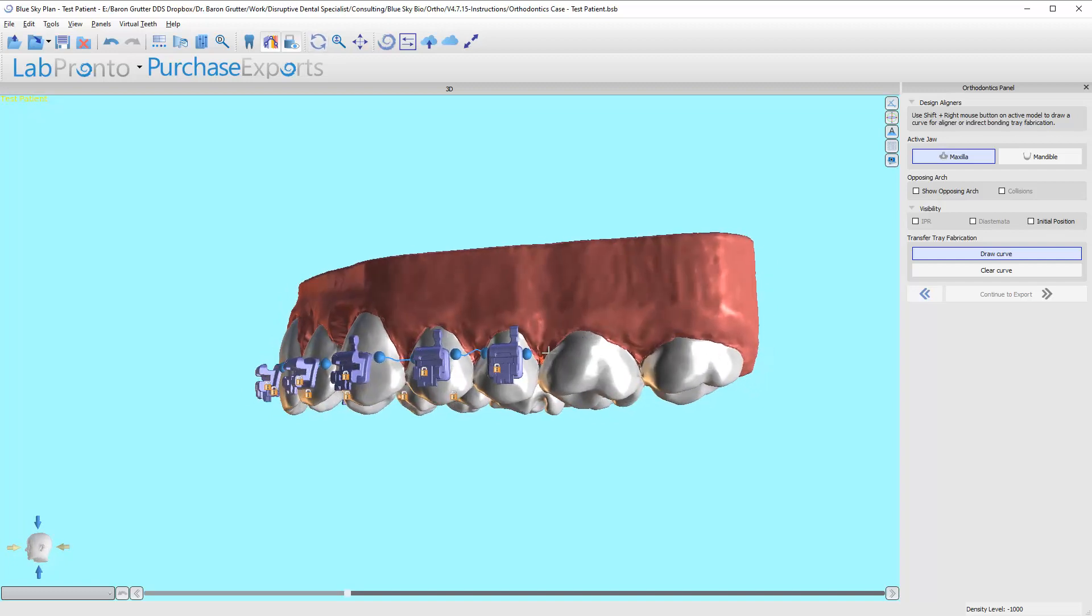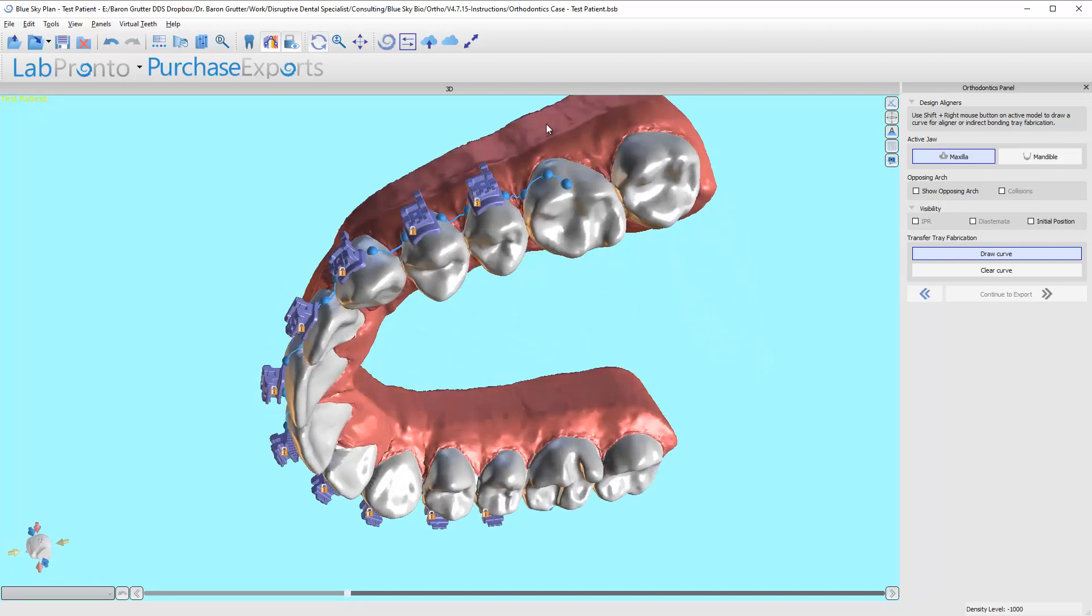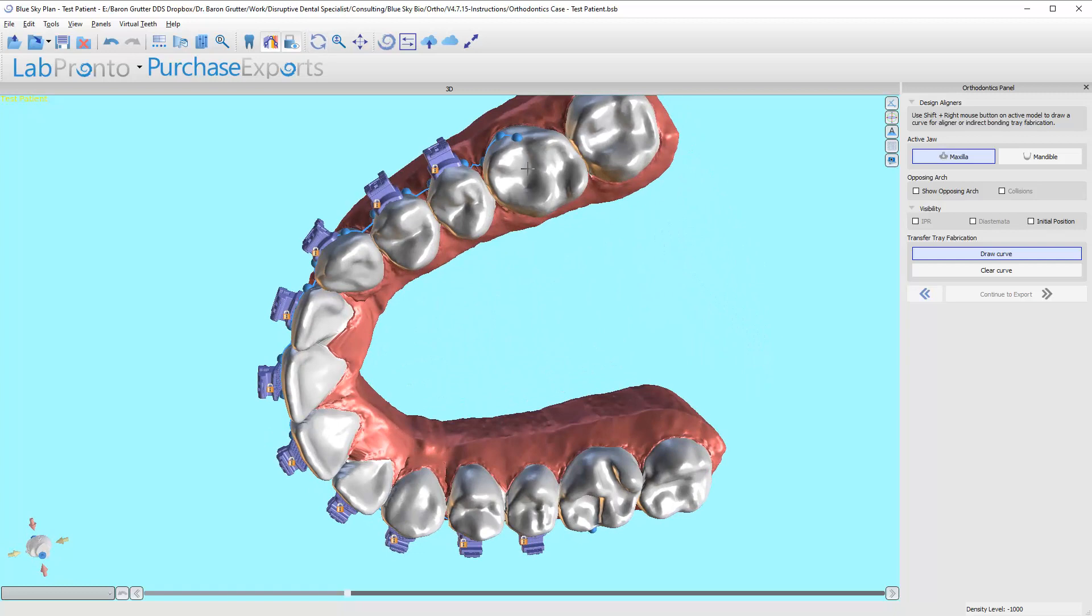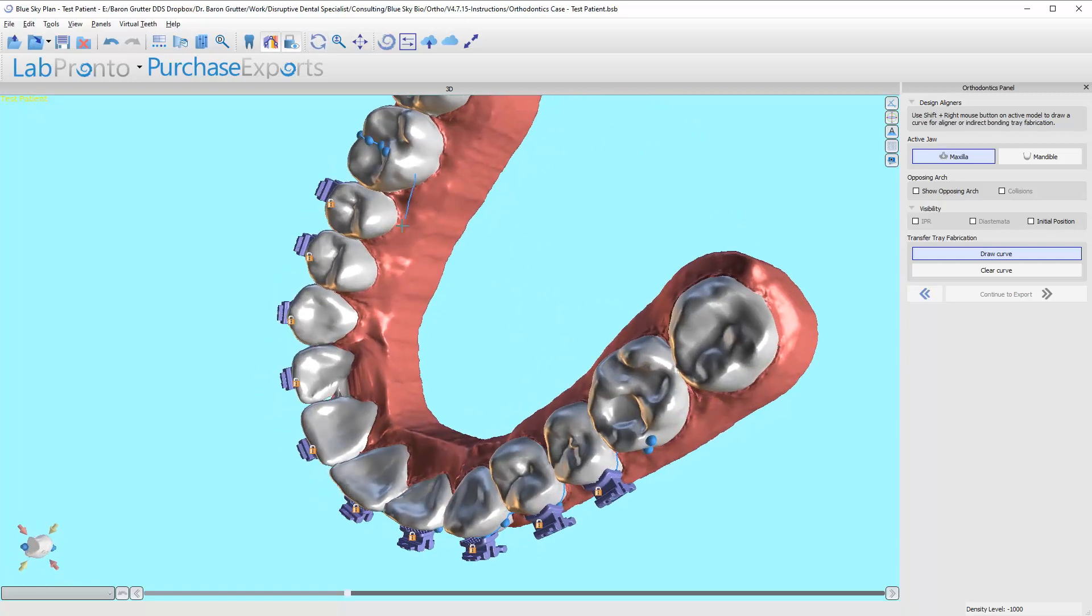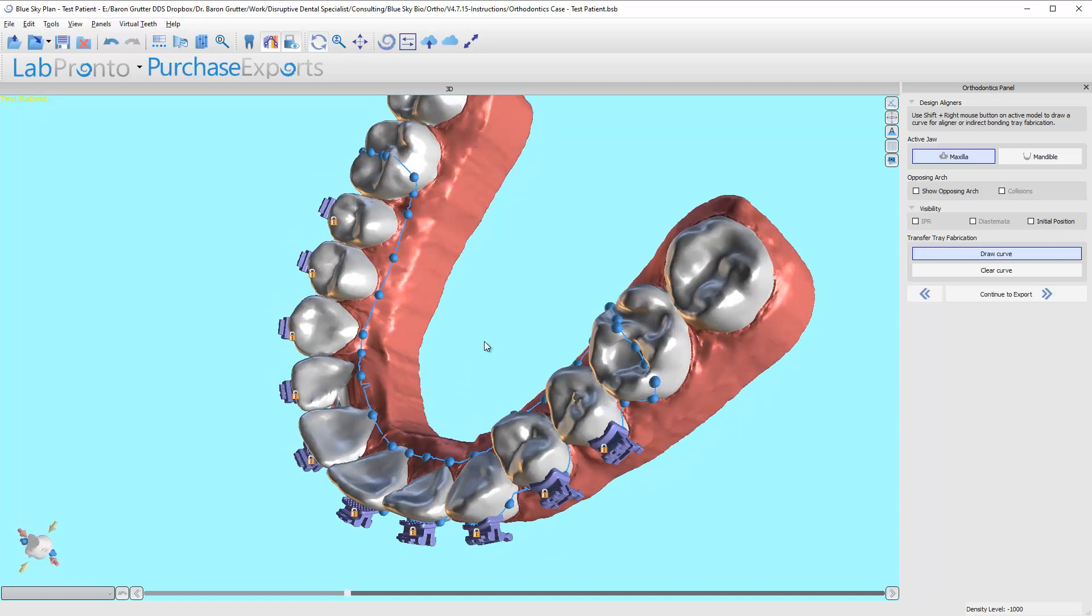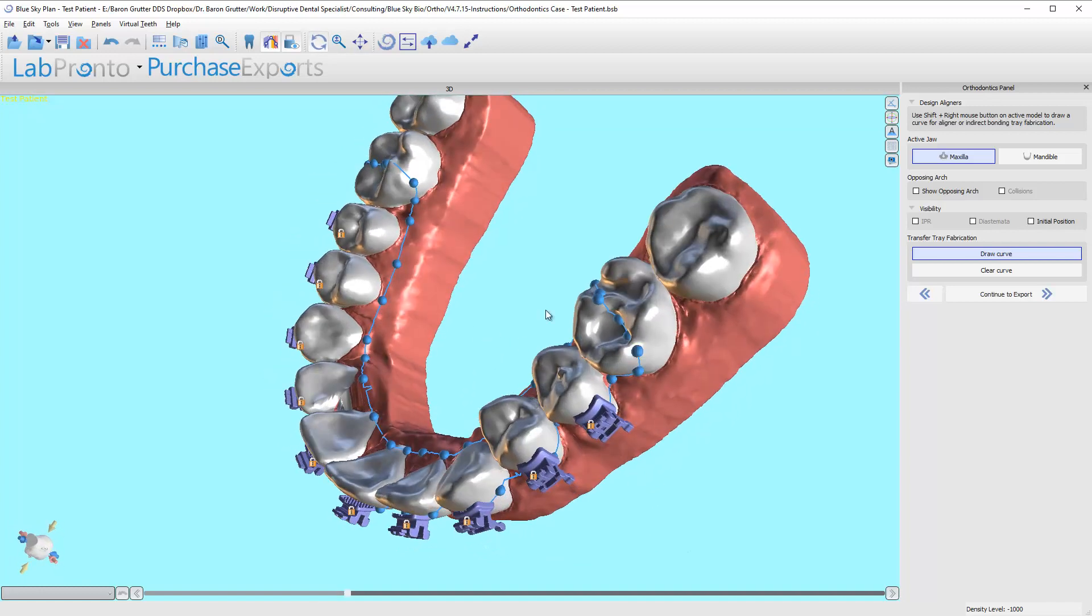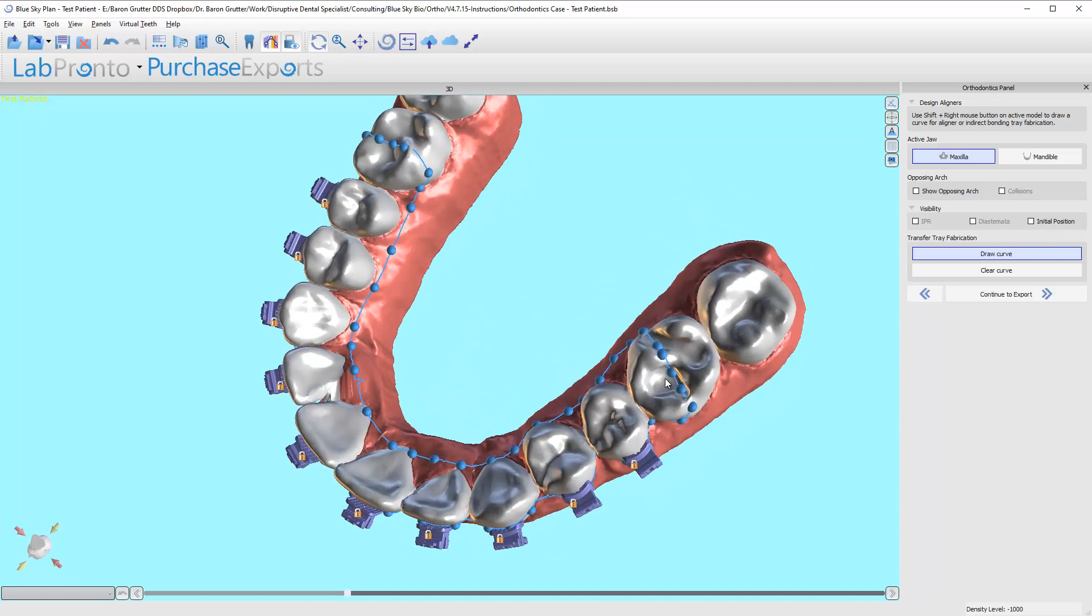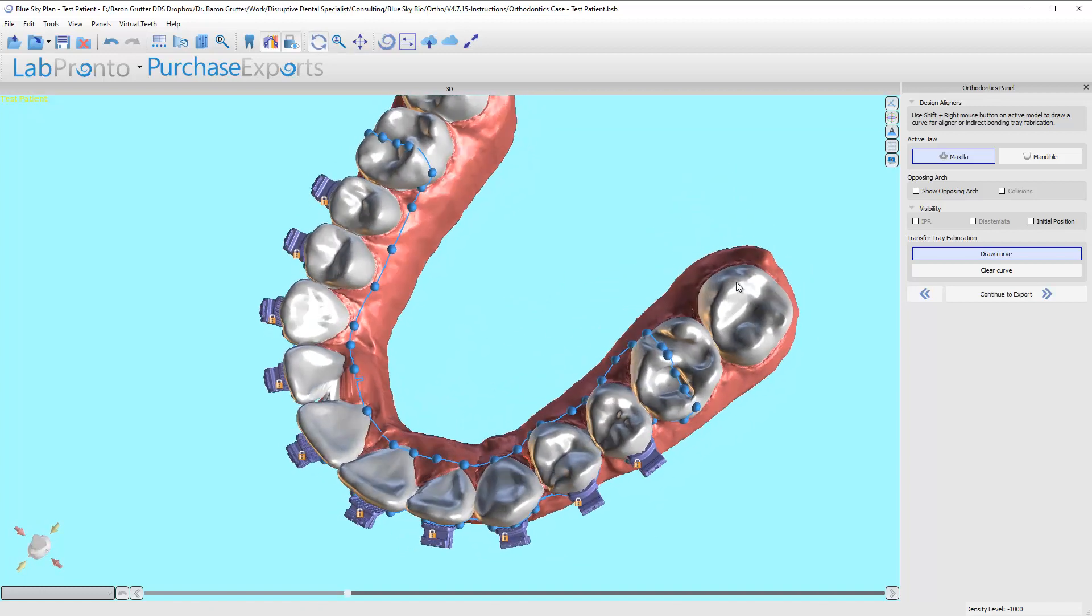Now I'm just showing you where I like to put it. On the lingual, this doesn't really matter—do whatever you want with it. And it automatically connected these two. That's it, I've drawn this one. Now let's go to the mandible and draw.